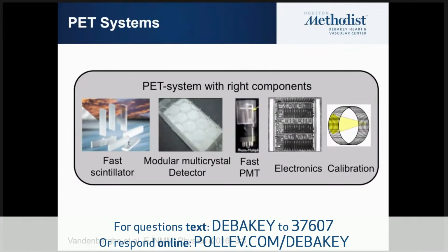So in PET, we use different detectors. The most commonly used are the LSO, or the lutetium based. Some older systems used to have the BGO kind of detectors. In contrast, in SPECT, we use sodium iodide, and then we have the electronics, and then we put it all in one detector. So again, zooming in, we get the whole block of detectors.